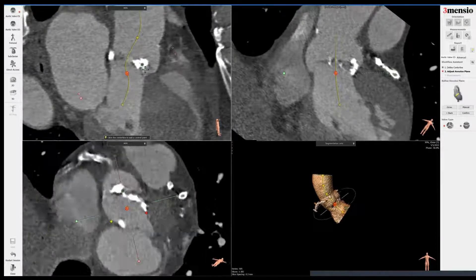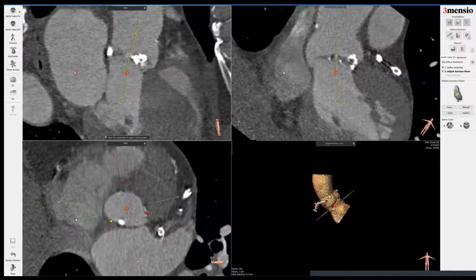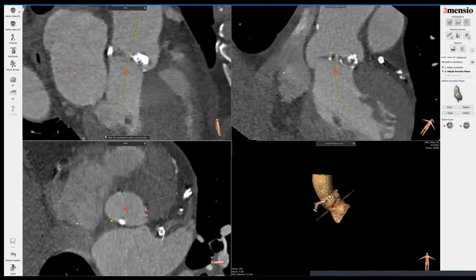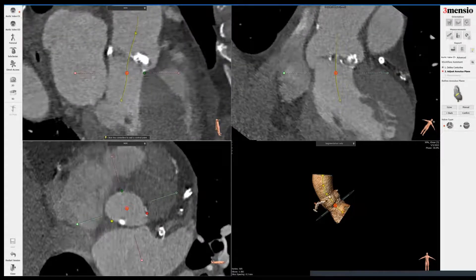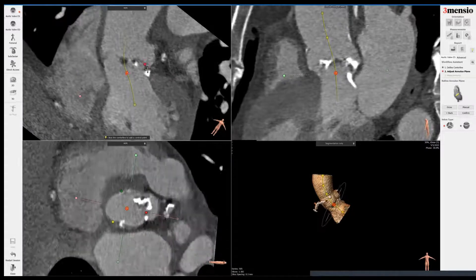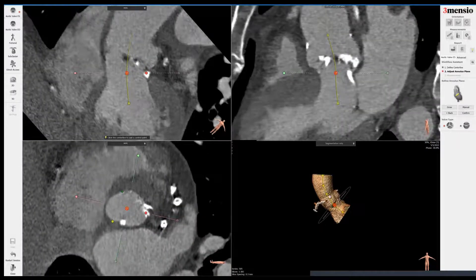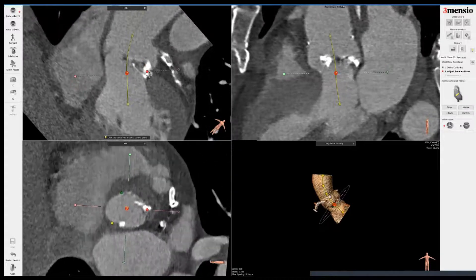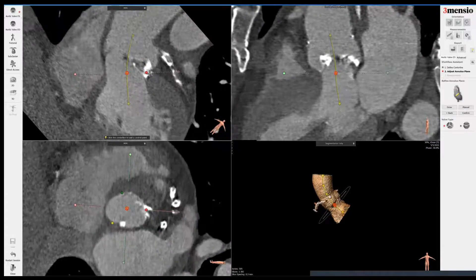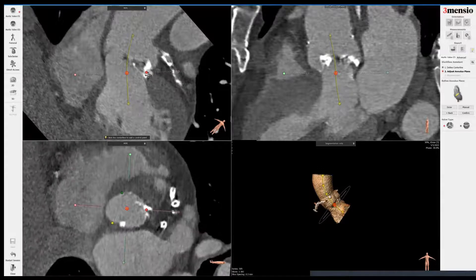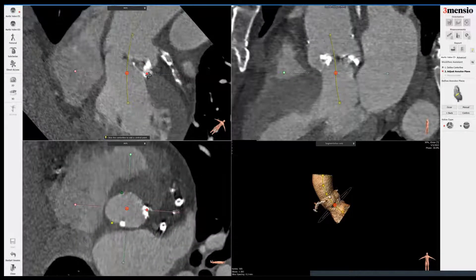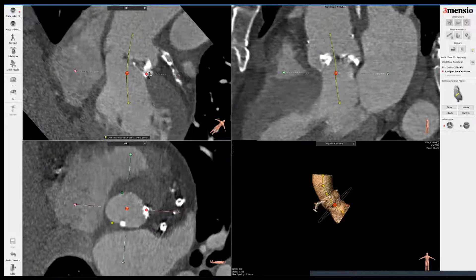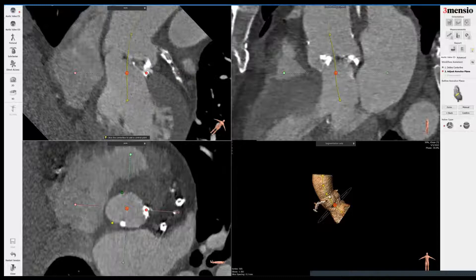That's going to be my non-base of my non-cusp. This is the right cusp — this is pretty good. This is the left cusp. Now when you have annular calcification, it can be very difficult to say where is the true annulus, so you just want to see the base of the sinus disappear. Sometimes motion artifact can be challenging as well. So I'm going to stop right here and show you how I would measure the annulus with this kind of calcium.